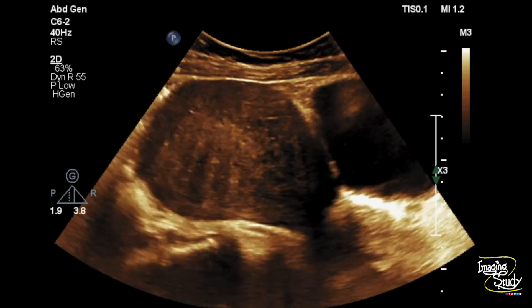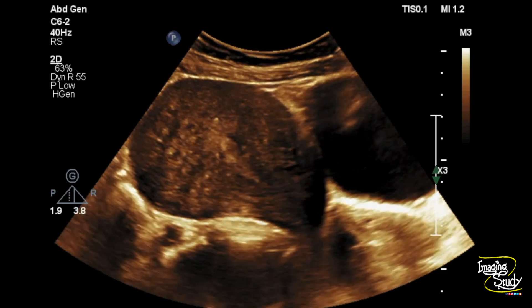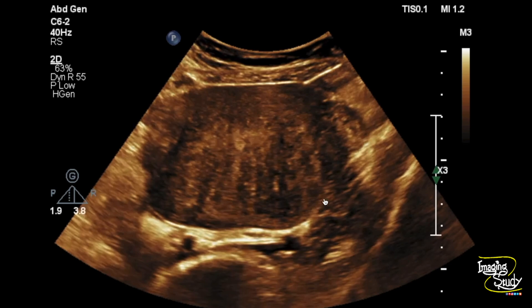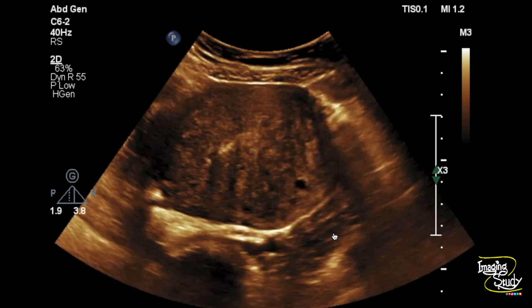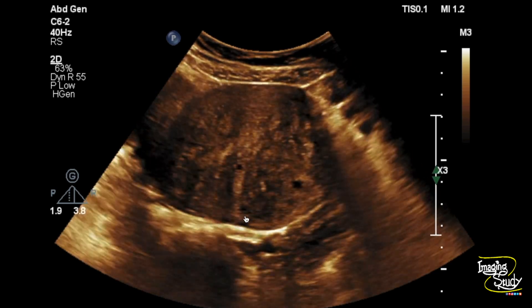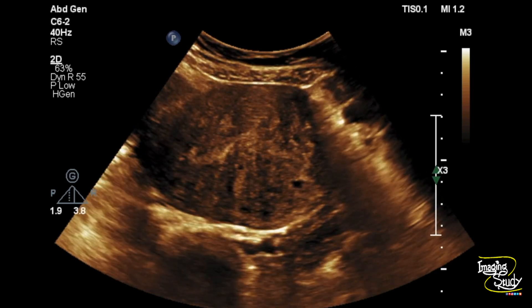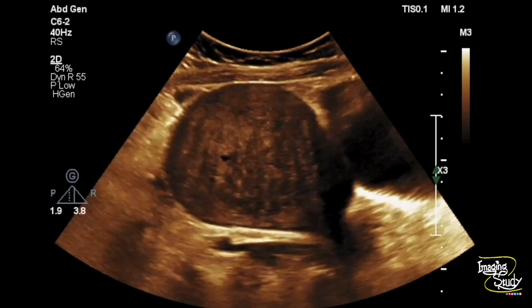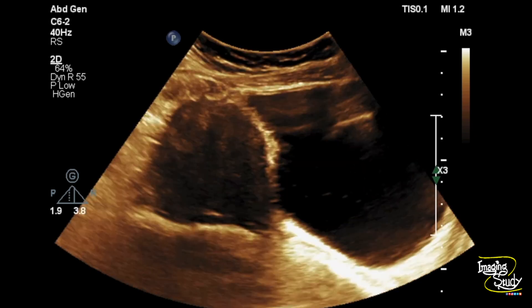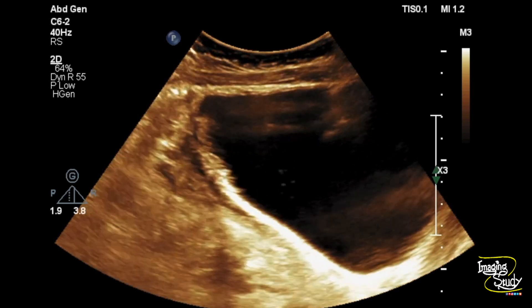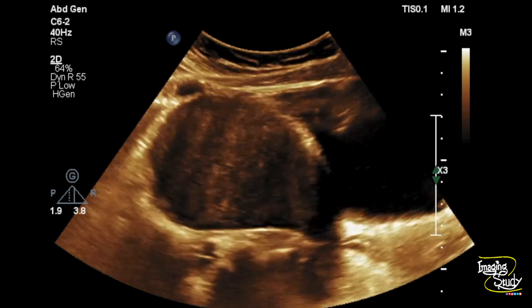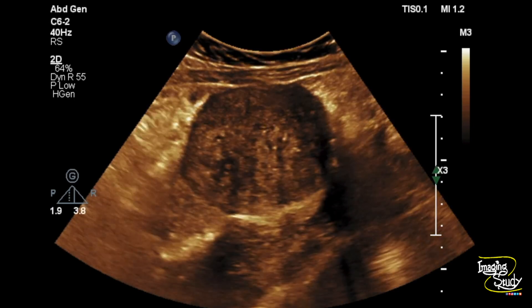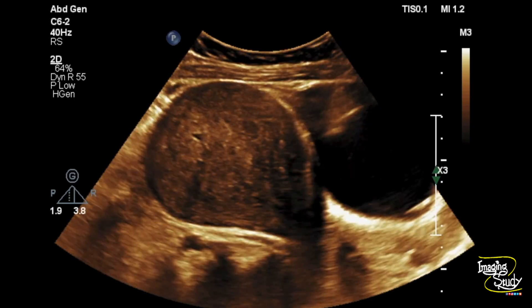If you look at the overall myometrium, about less than 25% of the myometrium is normal. When you see this type of adenomyosis with less than 25% of normal myometrium, it is called the diffuse type. The cervix has a tiny Nabothian cyst.